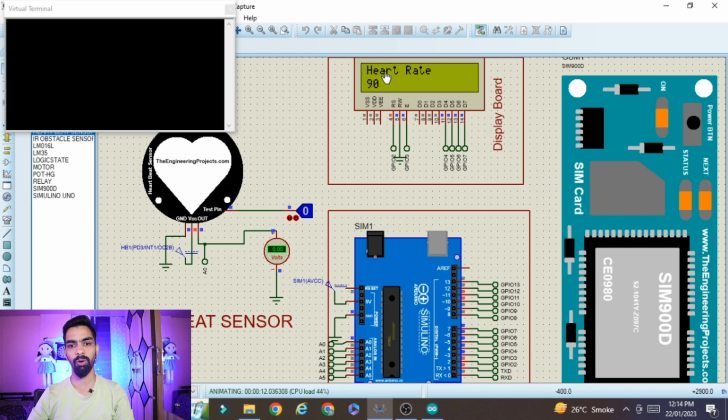Now you can see heart rate is 90. So count is like we may miss 2 high pulses. So count is 90, that is 10 into 9. So that's why no message is sent here. So this is the basic logic behind this project. I hope you understand the logic and working flow of this project.